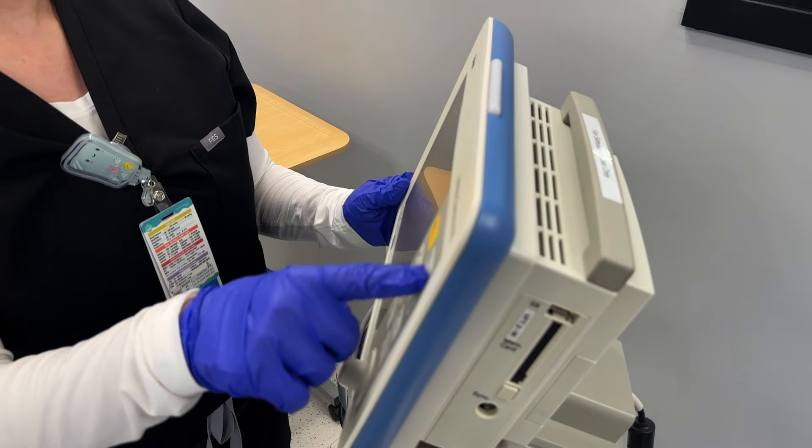Now you can run your 12-lead EKG. You can check out more step-by-step nursing skills here. Happy studying, future nurses!